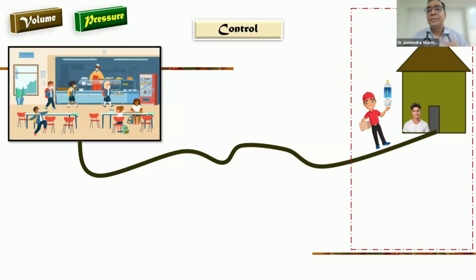Now, because of this agreement, sometimes you may become a little bit restless. You may require water in between, but it is not available. That restlessness, in our ventilation setting, we call asynchrony. Technically, this is a very, very old form of modes. Now, no ventilator actually has volume control and pressure control, though they mention the name volume control, but actually they are not in control. What the modes are, I'll explain in the subsequent part of this explanation.